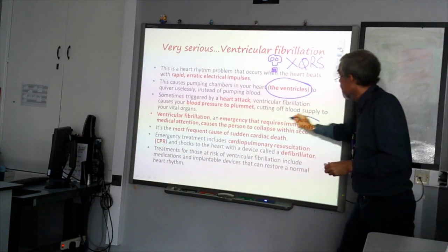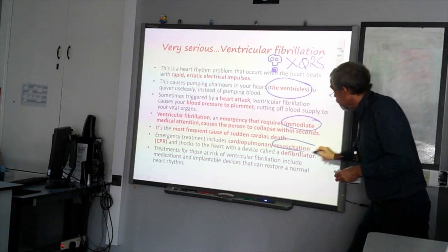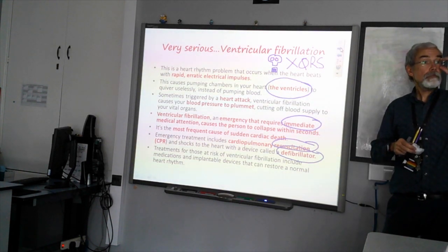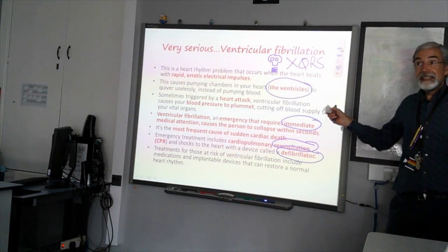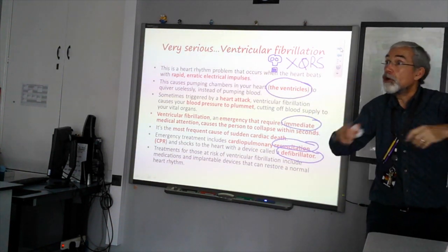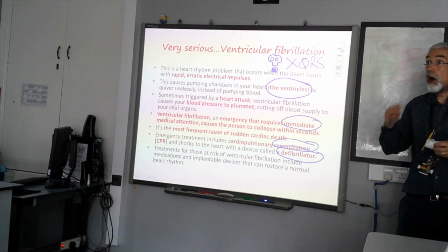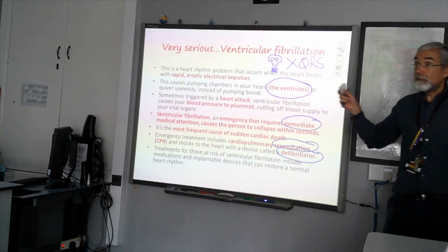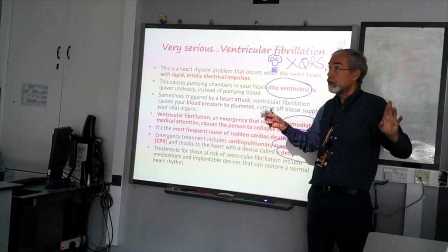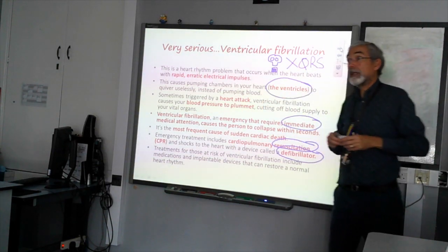This is an emergency, and it requires immediate medical attention, which would include resuscitation or the use of a defibrillator. So this is definitely one where you will be going clear, boom, in the hope that all the noise stops there, and then you start again, and the heart will start to beat again normally. It's a very reliable way of stopping the heart so it starts again properly.